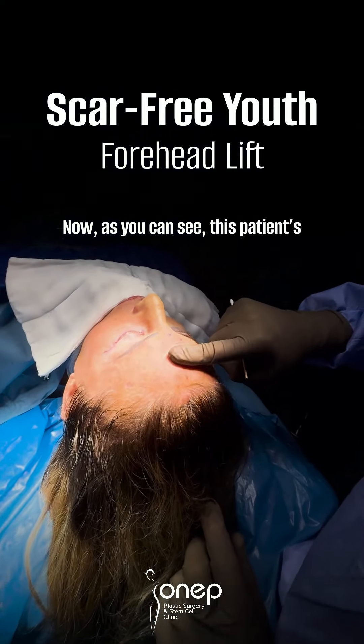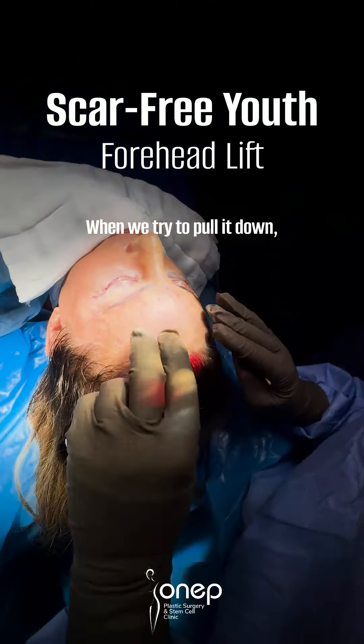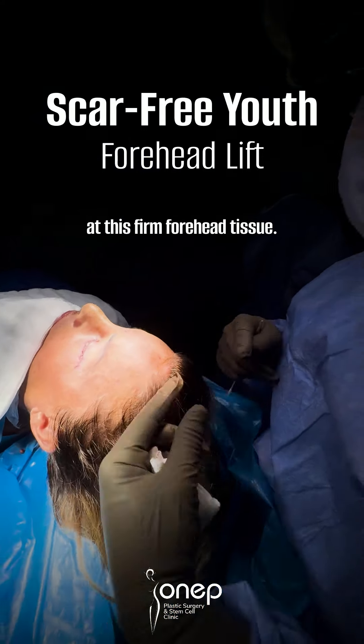Now, as you can see, this patient's forehead is maximally lifted. When we try to pull it down, it doesn't move — look at this firm forehead tissue.